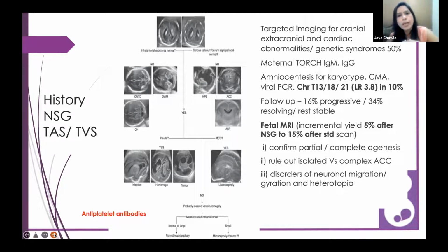Apart from that, we need to look at the supratentorial images, the anterior complex, to figure out if we are looking at holoprosencephaly, say for example, or any evidence of agenesis of corpus callosum with its spectrum of further workup that we might require, or there can be issues with the septum pellucidum that we need to deliberate further upon. Also, the look of the ventriculomegaly per se can give us some insight about the etiology, how it has developed.